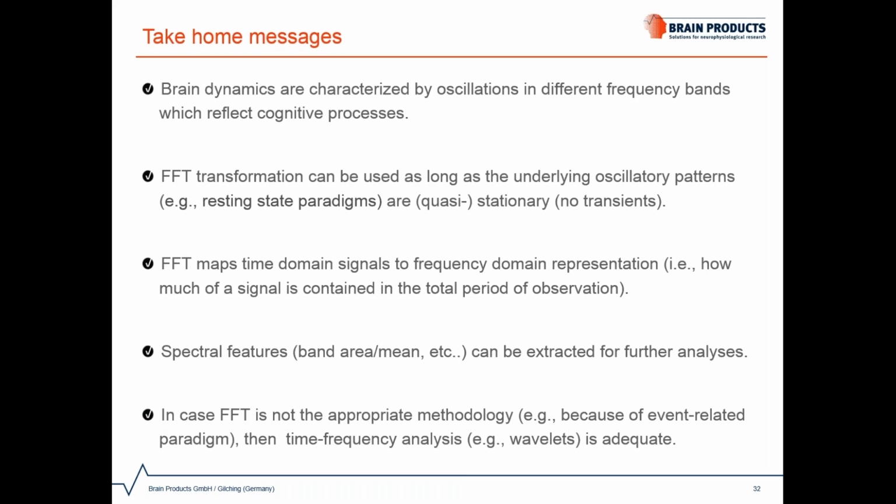So, in cases where FFT is not the appropriate methodology for your research goal, for example, in the case of an event-related paradigm, which was one of the questions from our open question session, you may need to consider other spectral decomposition algorithms like wavelets, which allow you to analyze the time evolution of the frequency pattern by performing the so-called time frequency analysis. And if you are interested to know more about wavelets, I would like to invite you to check the wavelets chapter in the Analyzer user manual.